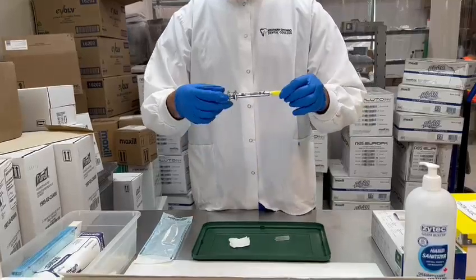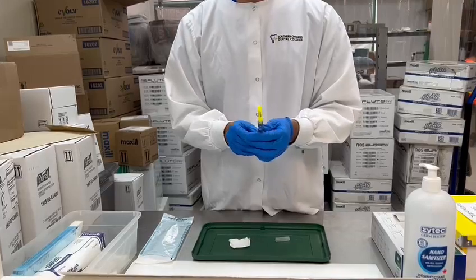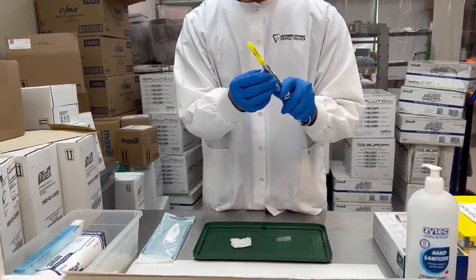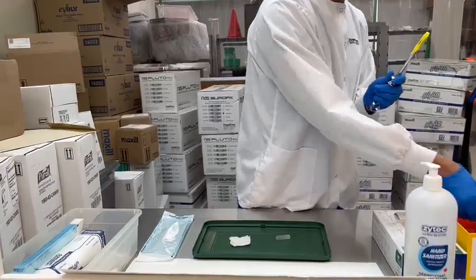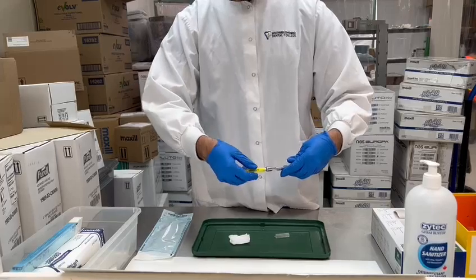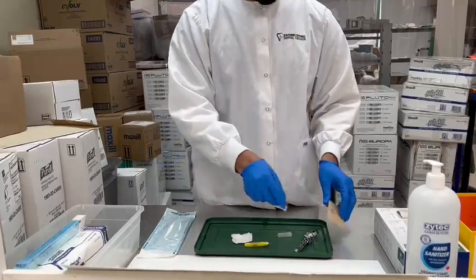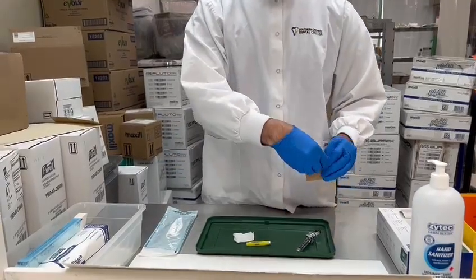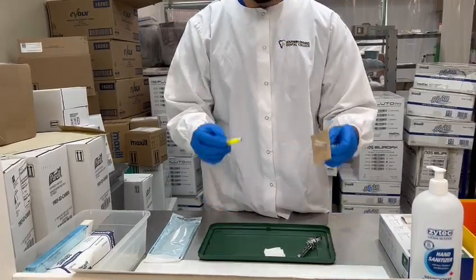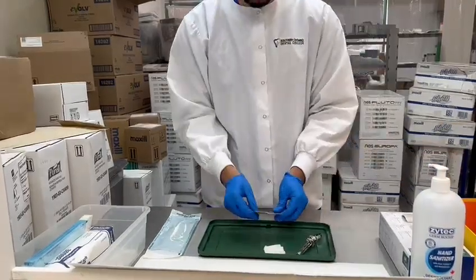After you're done, we can give it to the dentist. After he's done, we disassemble it again. We start by taking off the carpule and putting it in the sharp container, then take off the needle. We use a cardboard piece to safely put the needle into the cap and it goes into the sharp container as well.